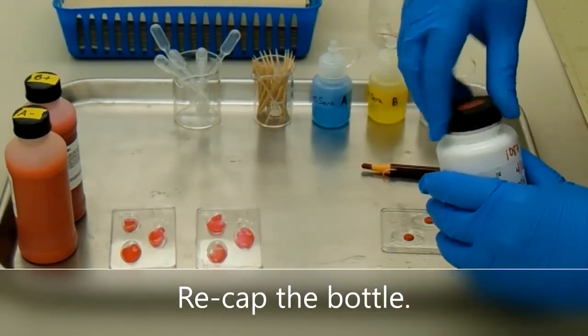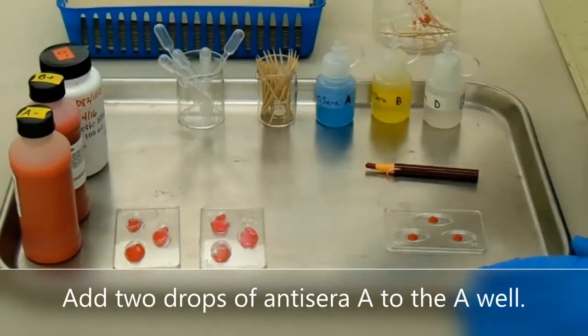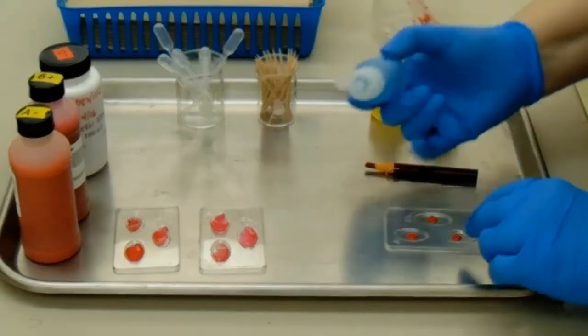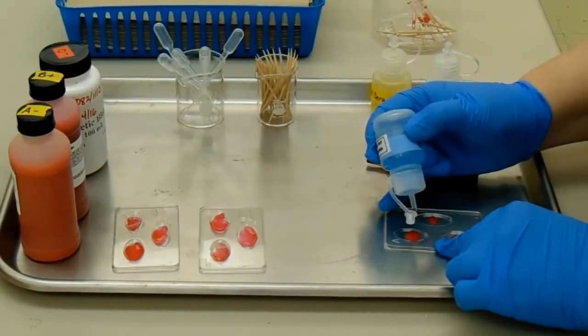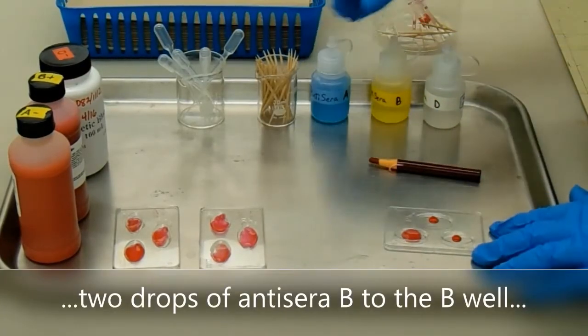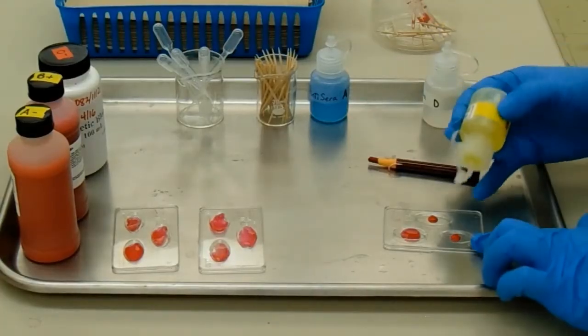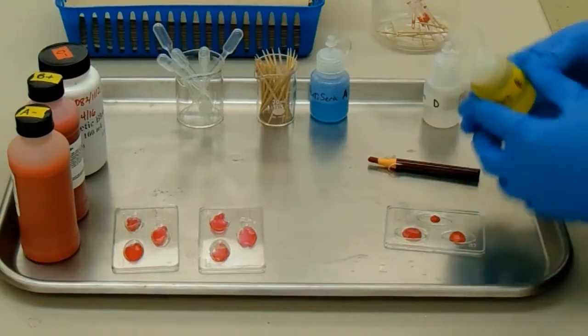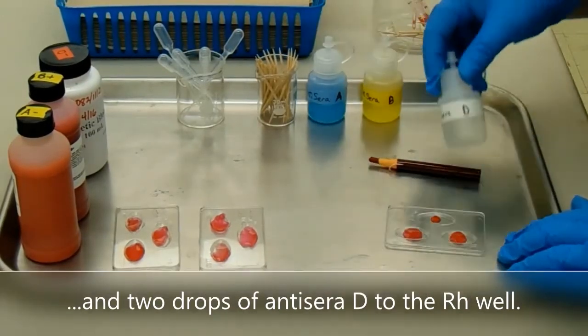Put a small amount of blood into each well. Recap the bottle. Add two drops of antisera A to the A well. Add two drops of antisera B to the B well. Add two drops of antisera D to the RH well.